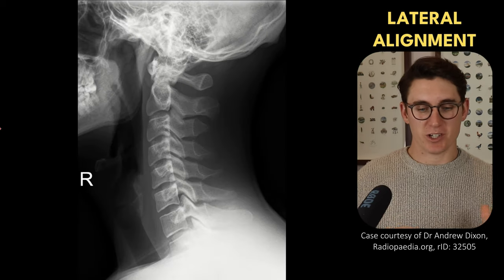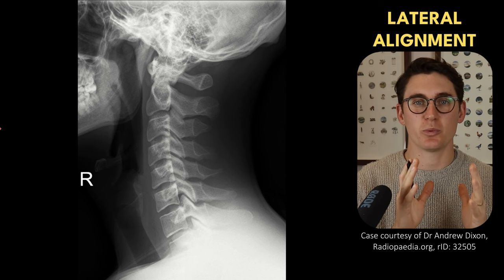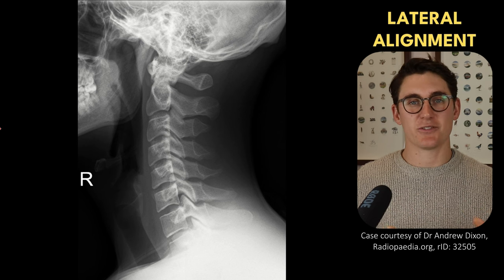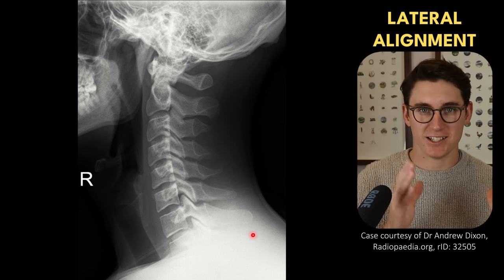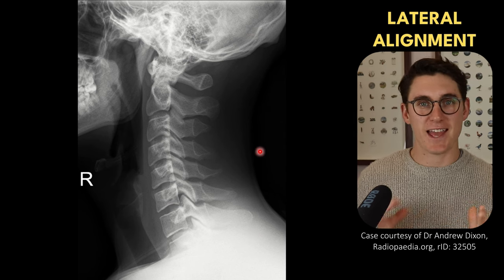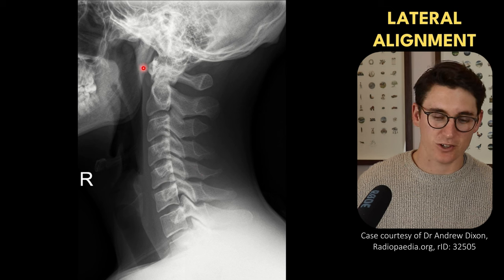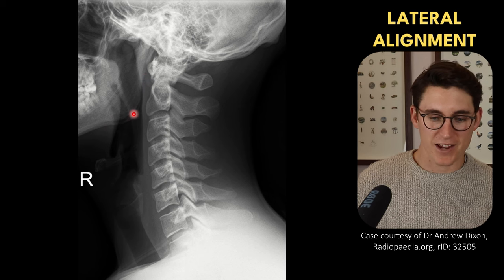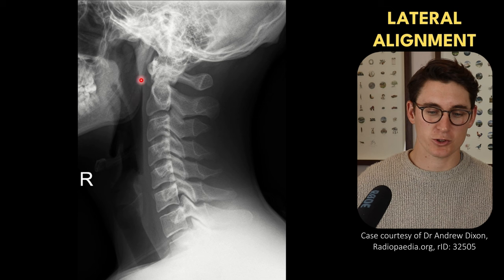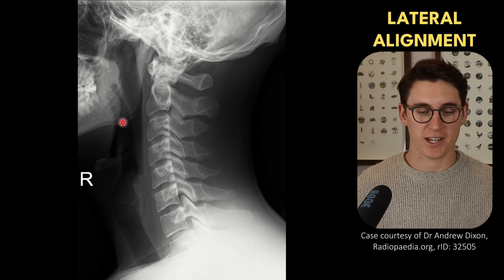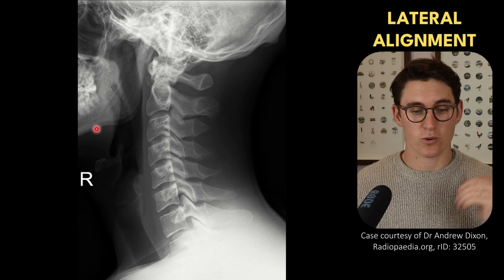Let's start with our lateral x-ray — we can get probably the most information from the lateral, so it's a good place to start. The first thing I like to do is make sure we've got correct alignment, as malalignment of the spine is a great indicator for something being wrong. To check the x-ray itself is not rotated, the best way on a lateral cervical spine is to find the angle of the mandible. On the posterior surface, the left and right mandibles should line up well — any rotation would cause malalignment of those posterior surfaces. We can also check for lateral tilt by looking at the inferior surfaces and seeing they're generally well aligned.